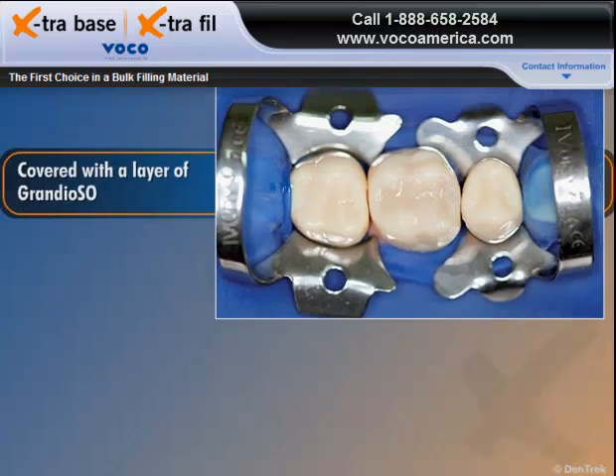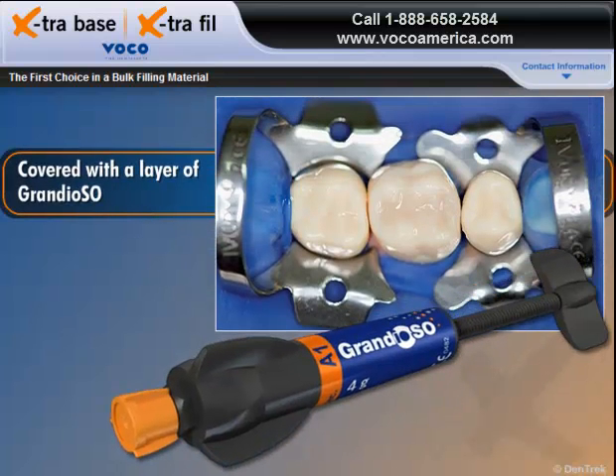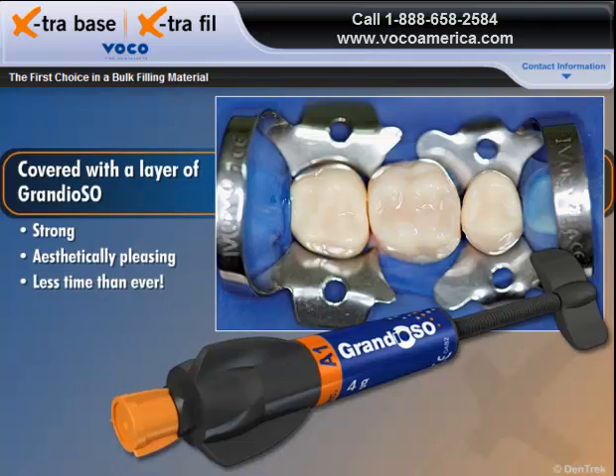When covered with a layer of Grandioso Universal Composite, Extra Base lets you produce strong, aesthetically pleasing posterior restorations in less time than ever.